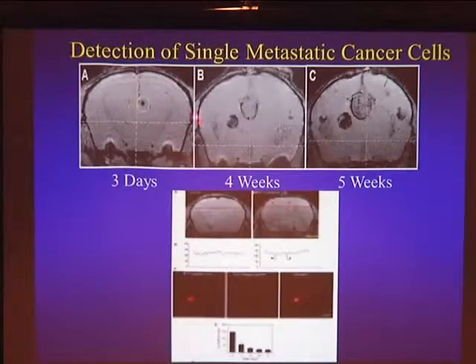But she didn't know whether she was preventing metastasis or growth of tumors with her treatments. And so we just set out to count cells. So here's just a few days after injection of the cells, and you can see here's a cell labeled with these MPIOs, and you can actually watch this turn into a tumor. I think here's another cell. This one's a little bit slower. The tumor's not growing as large as quickly.